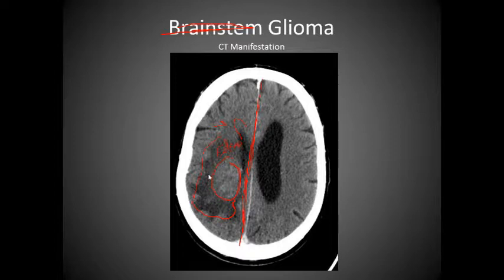Look for a mass seemingly on the inside of something like edema. So you're going to have hypodensity. If we draw it over here, we're going to have hypodense surrounding an area that is hyperdense than this.